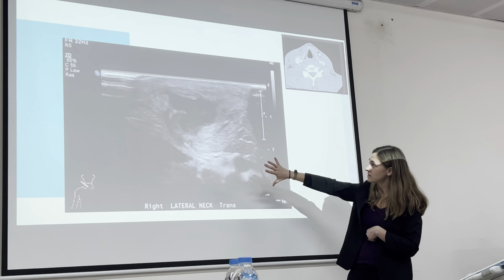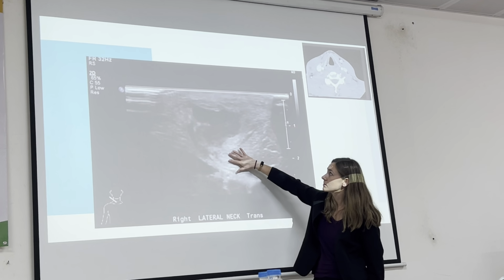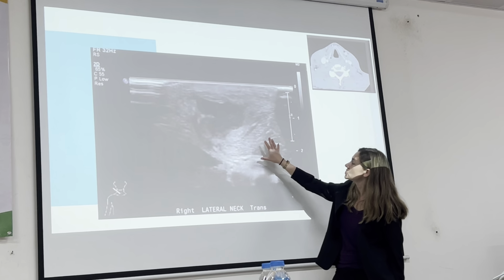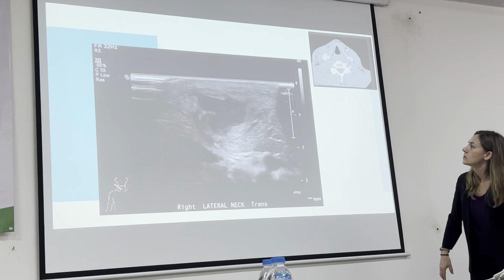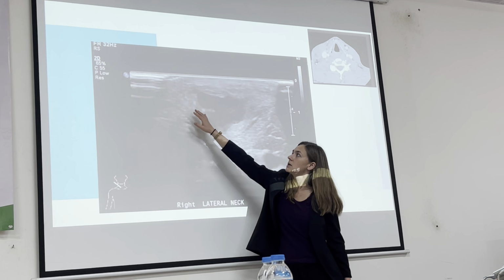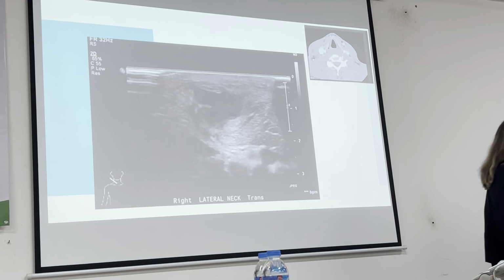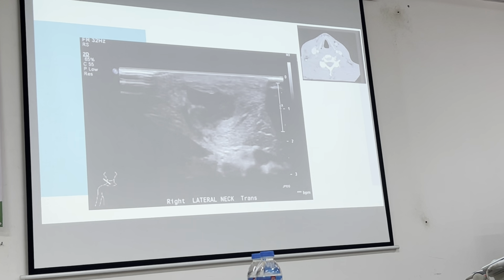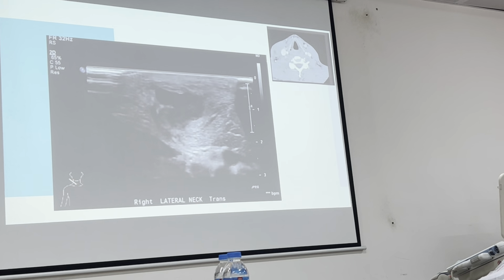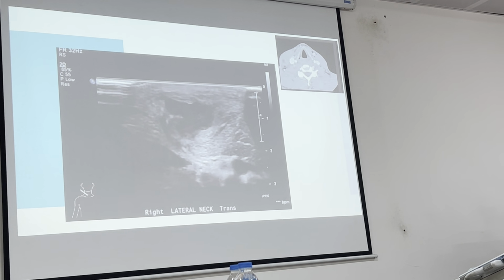And I hear what you're saying about some of the hyperechogenicity, the white. I see a little bit of it here. Hard to say, maybe a different view. And then if you start looking at the surrounding tissue, if we take a step back, we see some of the cobblestoning up around here, around both sides. We see a thickening of the dermal and epidermal layer. So those things taken into account. And if you look up at the CT scan, it's hard to see, but there is a dark spot in the middle, which makes me think that there is fluid in here.